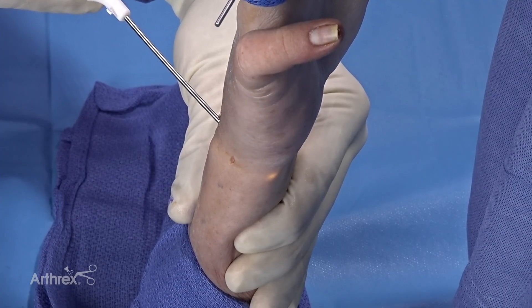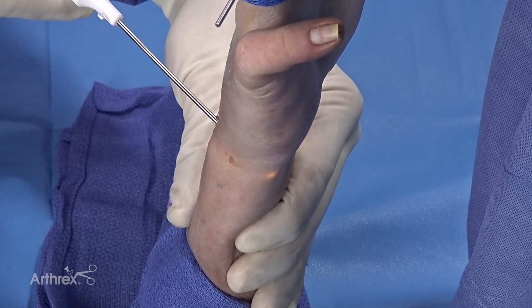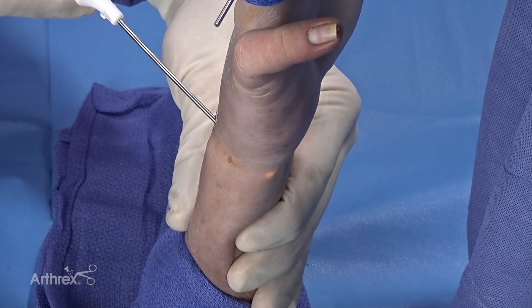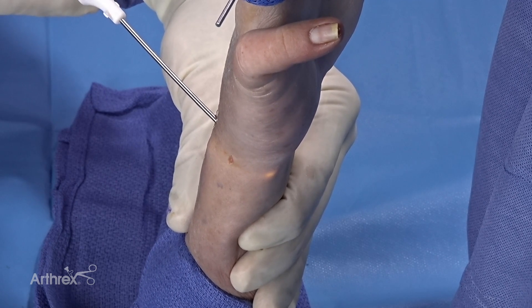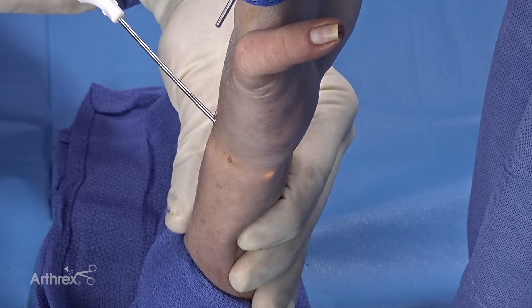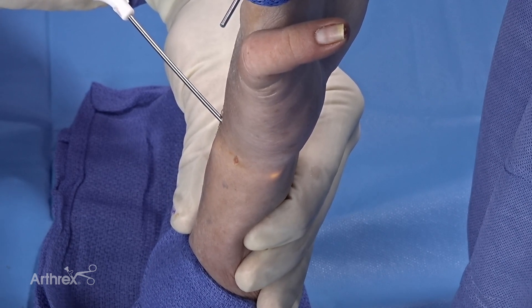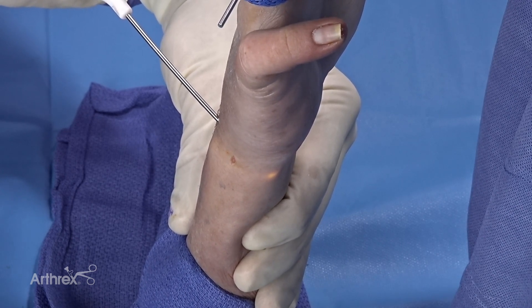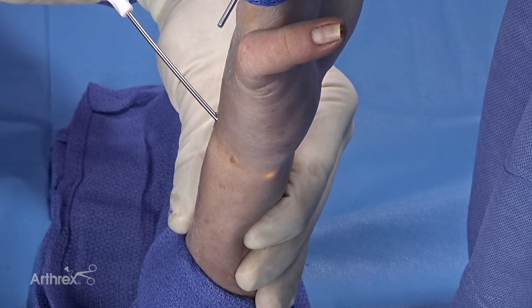Now we're going to make the accessory portal for the DRUJ. You can do this dorsally with a dorsal accessory portal, or we can make the direct foveal portal. Using the nanoscope — remember it is flexible — you can come over the ulnar head underneath the TFCC, and you can see the transillumination in the skin there. This will allow us to pass a needle and then pass our other arthroscopic equipment through. Be careful of ulnar neurovascular structures in this area, such as the dorsal sensory branch of the ulnar nerve or the ulnar neurovascular bundle, but pointing to the ulnar aspect we should be safe.